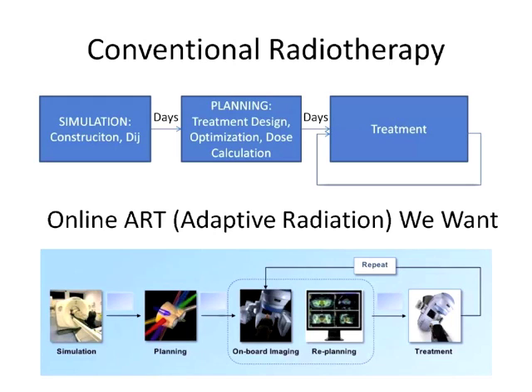So he has to do the radiation treatment design, and some of this treatment design has to coordinate with the radiation equipment, which has a photon or electron or other radiation source, and some practical configuration.